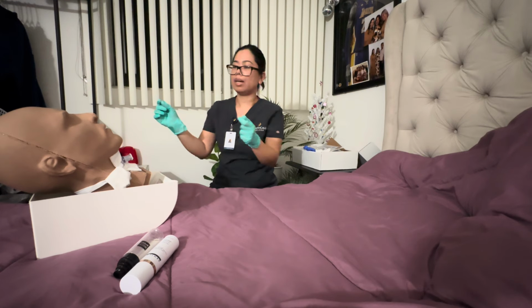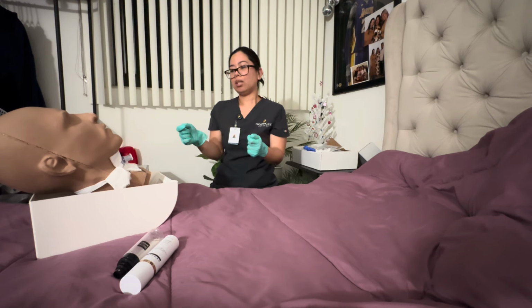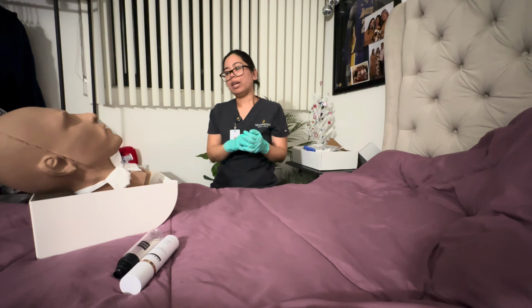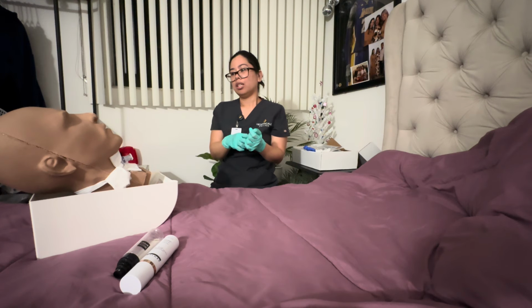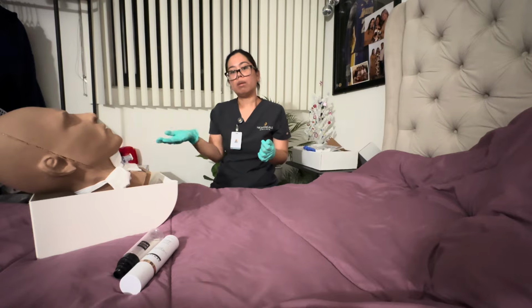So we're gonna replace the oxygen source to the patient so that the patient is able to get that oxygen again. And then we're gonna lower the bed all the way down, and we're gonna make sure the call light is within reach, and ask the patient if this is the position that they want to be in.